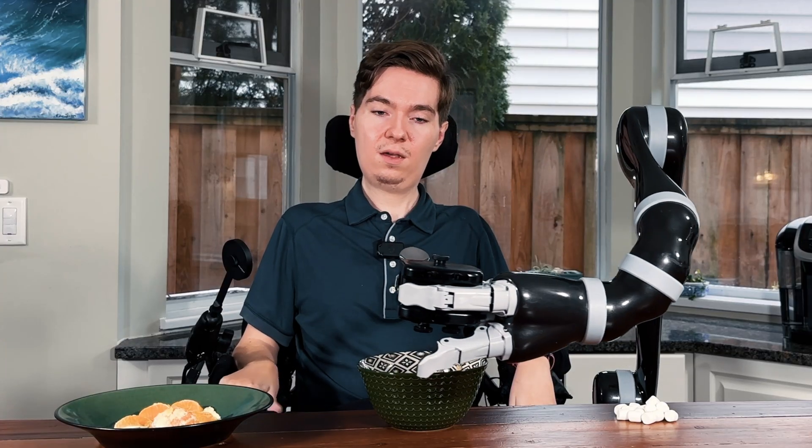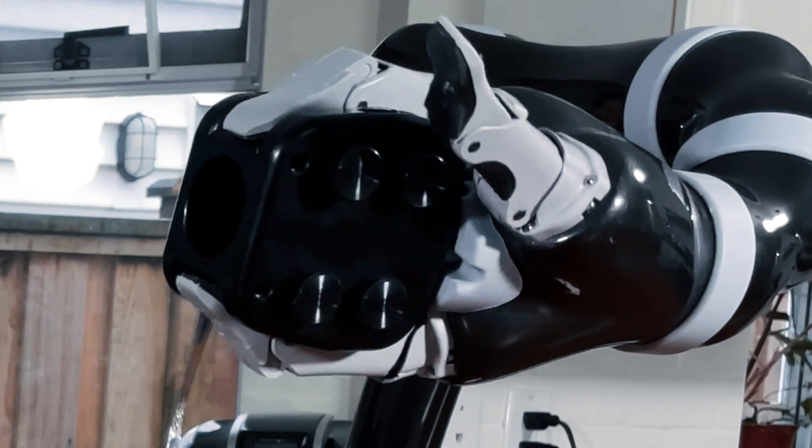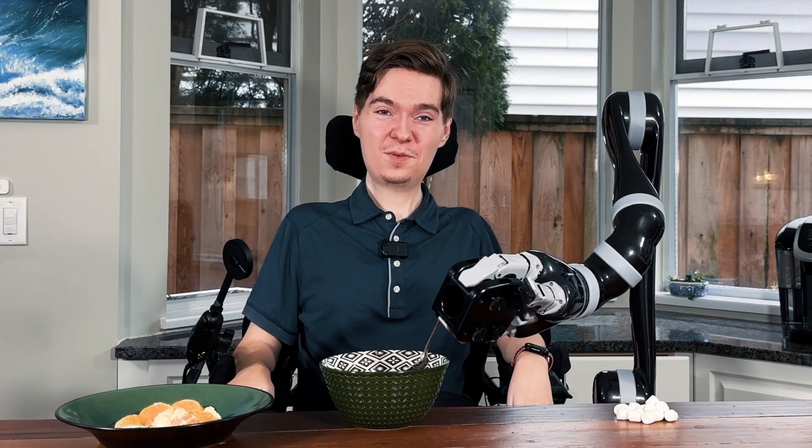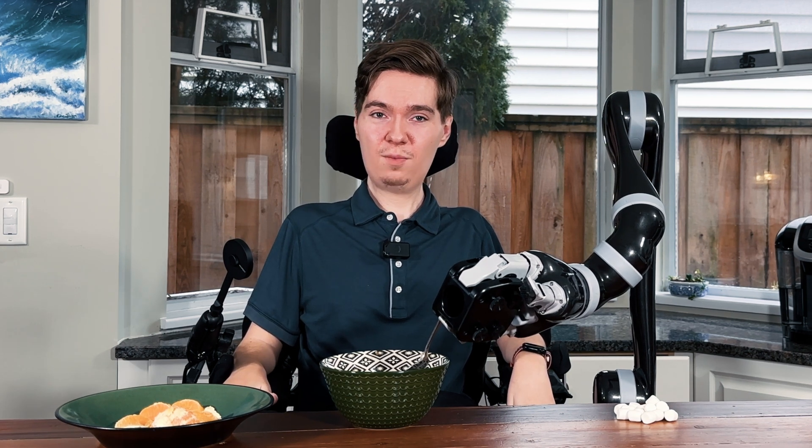There are some screws which can be turned by hand — you can see a couple here on the bottom. By turning those, it's going to clamp down on that spoon and create a very tight grip. In front of me here I have some oatmeal, or it may be called porridge where you are. It's basically just some oats and milk, and it makes a great breakfast.